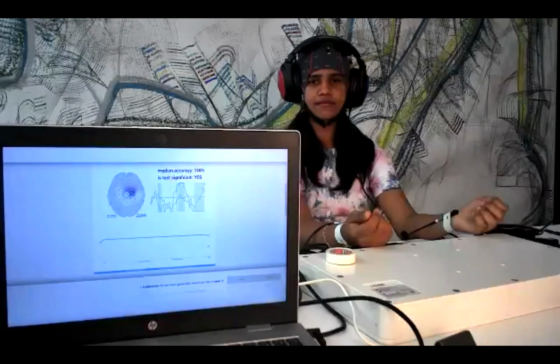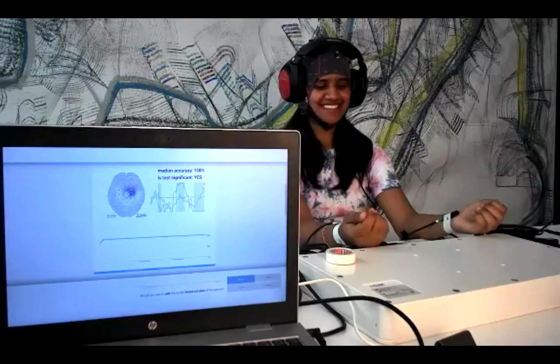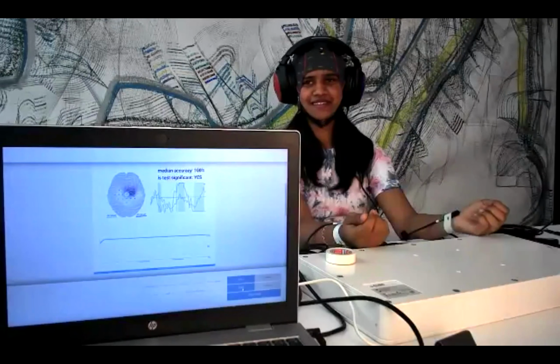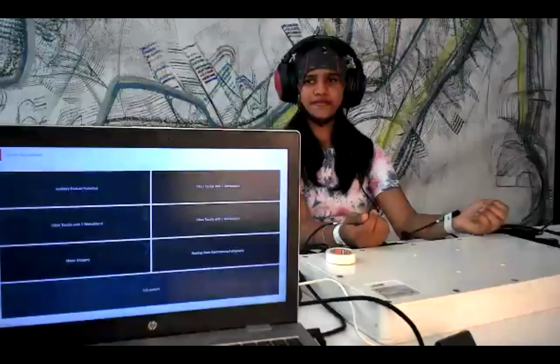And we can already see the accuracy plot. It already reaches 100%, I think, after 1 or 2 averages. So signal to noise ratio is perfect. We can also save this data and also add it to the historical data because we know this is very valuable data from Ashani. It's a great achievement. Although I'm talking and moving, but still got a very perfect accuracy.